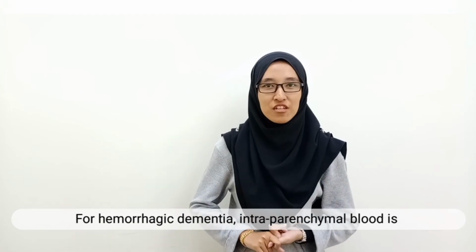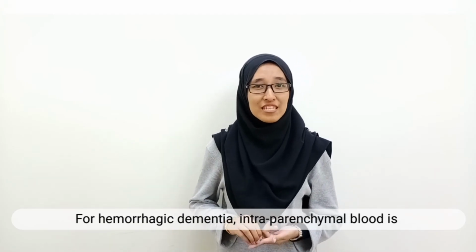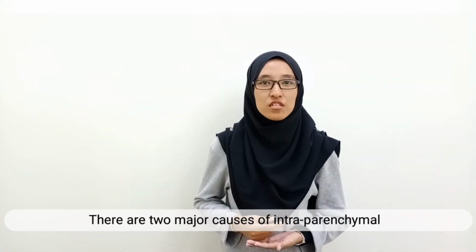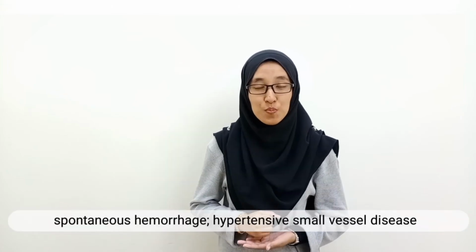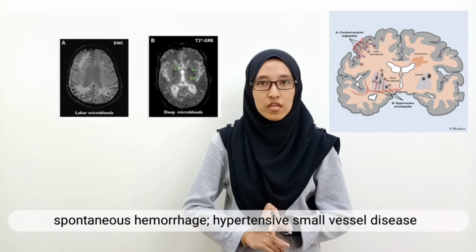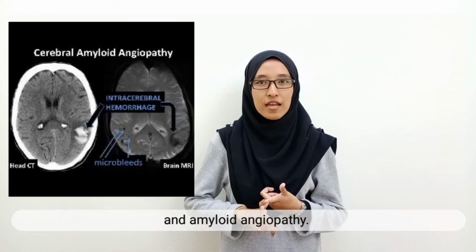For hemorrhagic dementia, intraparenchymal blood is easily detected by CT. There are two major causes of intraparenchymal spontaneous hemorrhage: hypertensive small vessel disease and amyloid angiopathy.